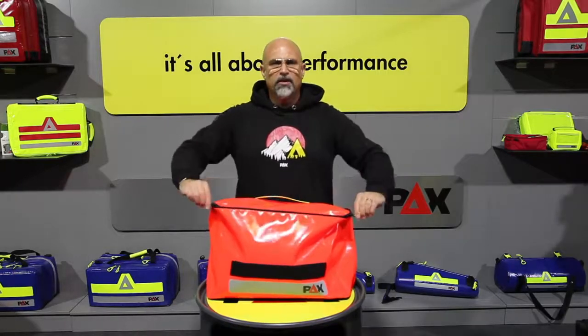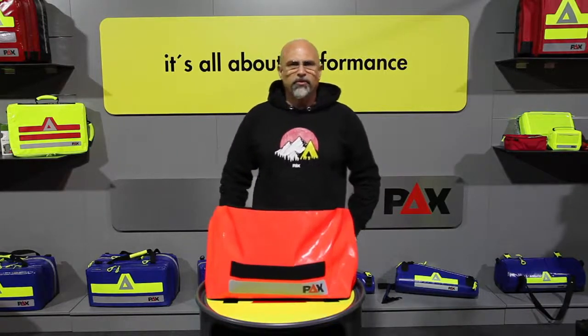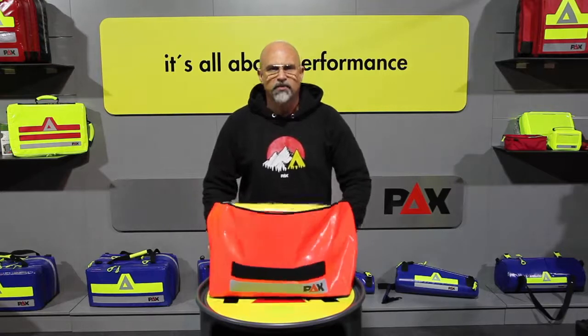The PAX infection protection bag is ideal for the storage of the complete equipment during infection protection missions and transports. Inside there are three separate color-coded compartments that allow the storage of infection protection equipment structured according to the protection level concept.